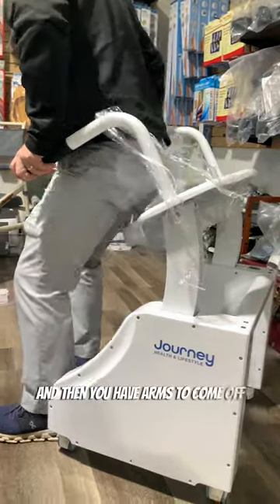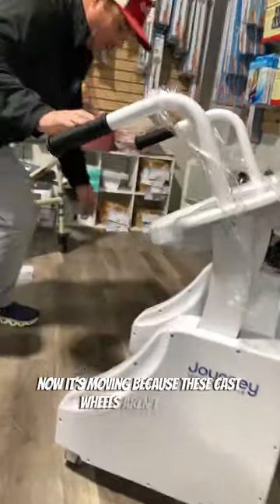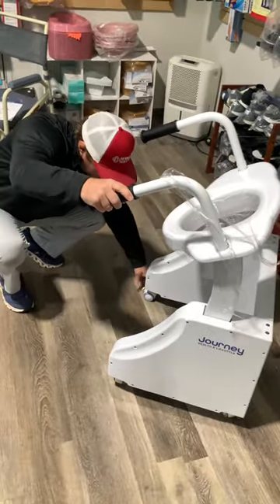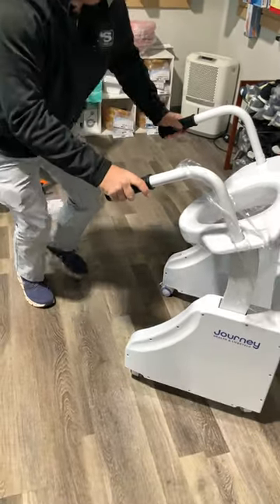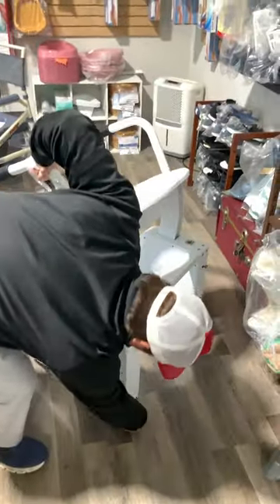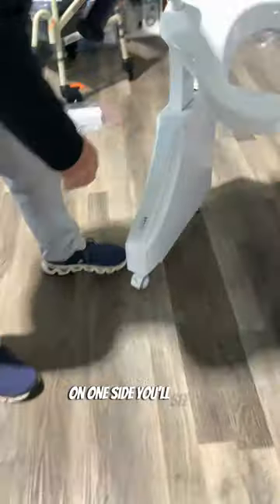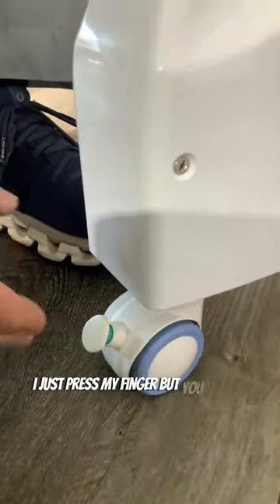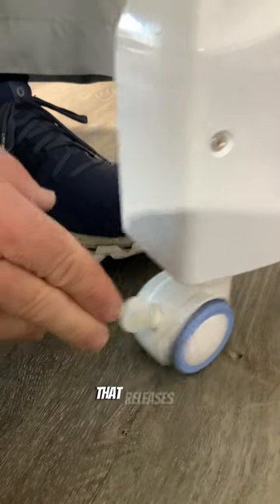And then you have arms to come off. Now it's moving because these caster wheels aren't locked, so you would lock these. Now it's locked. How you lock them — on one side you'll see it; you can step on it or press it with your finger like that. That releases it so you can roll it, then lock it again.